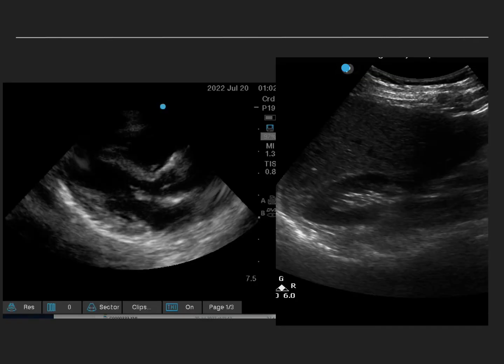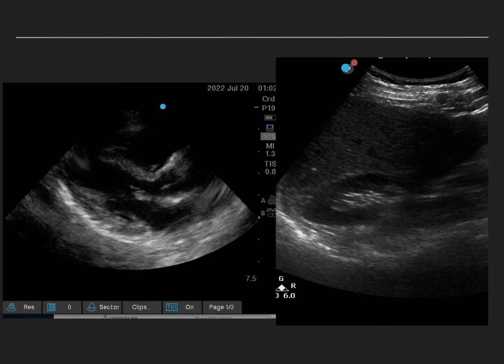Before we move forward, it's important to understand that the screen orientation in echocardiography is slightly different from other scans such as FAST scan, triple-A assessment, or IV access. In echo, the dot on the screen faces towards the patient's left side, whereas in other scans the dot is on the patient's right side — exactly the opposite. The cardiologists prefer to keep it that way.